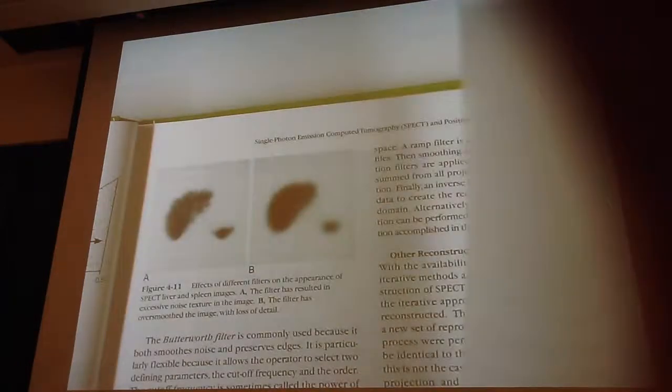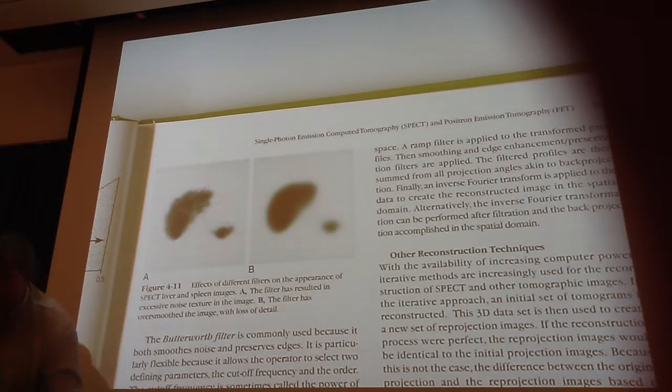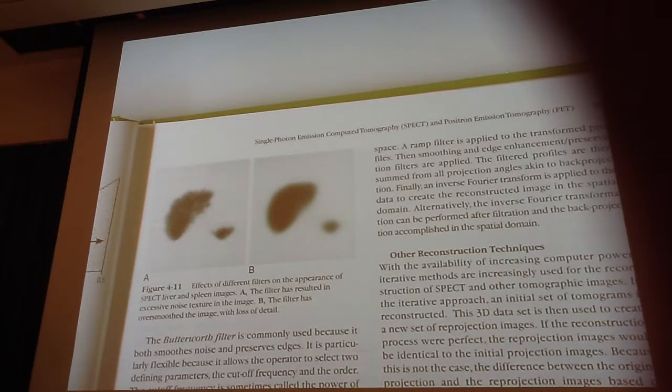So, one of the other things that we do is after we acquire the image, have any of you ever seen what a 64 by 64 matrix looks like? Let me see if I think there's a good picture of it here.